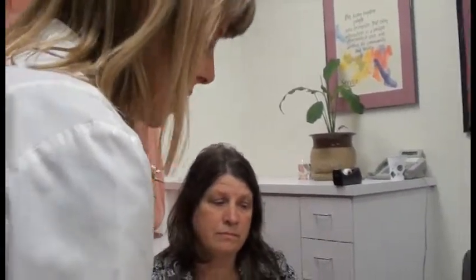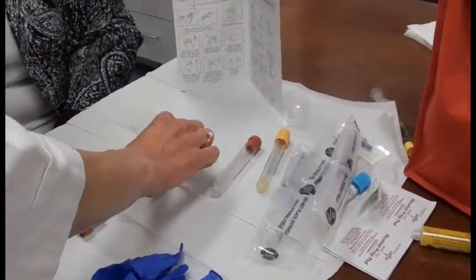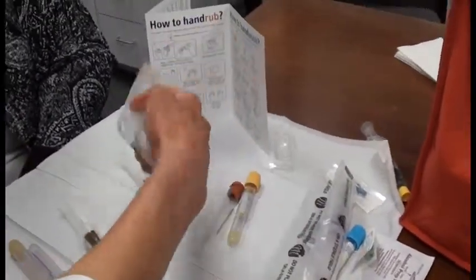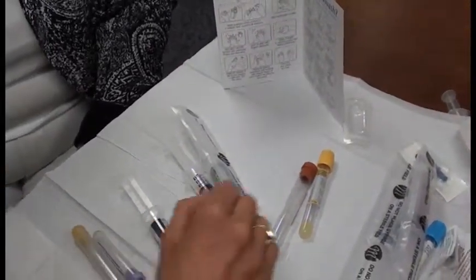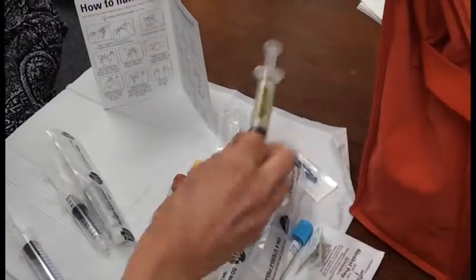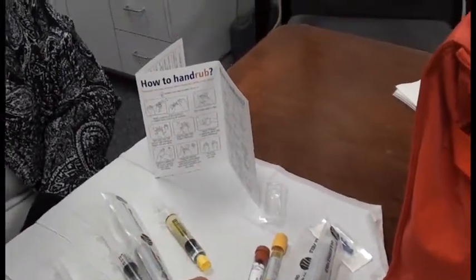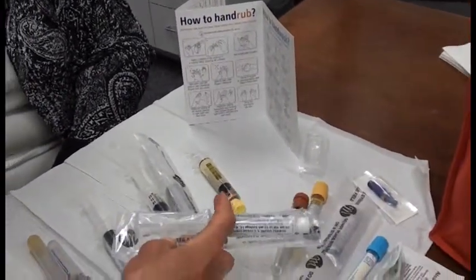Other than TPN, just a regular lab draw, you would need 1 syringe for your discard. You would need 2 saline syringes for your follow-up flush. And if your line was not valved, you would also need your additional heparin. And you would also, of course, need your syringe for the actual lab draw.